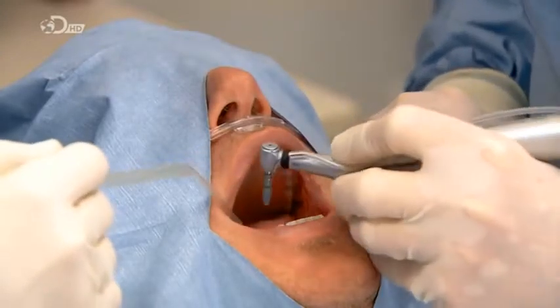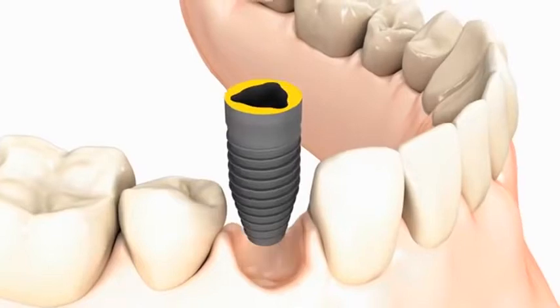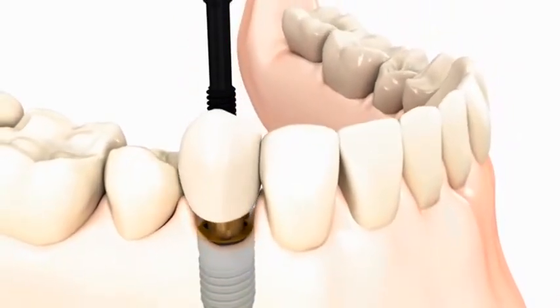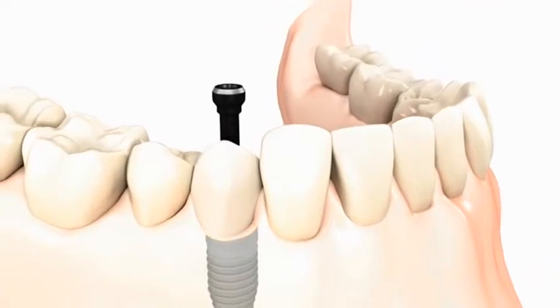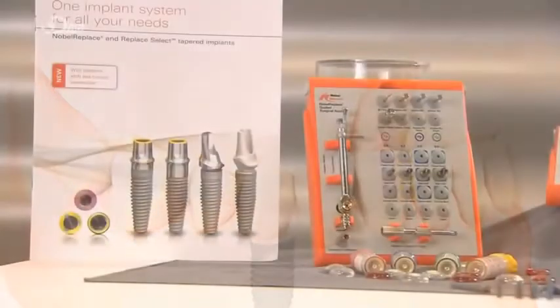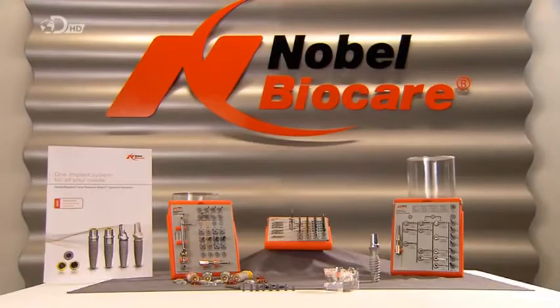The clinician screws the implant into the patient's jawbone and then secures a made-to-match ceramic tooth to it. Over time, bone will fuse with this artificial tooth, providing a long-lasting tooth replacement and giving the patient every reason to smile. Open wide. Thank you.